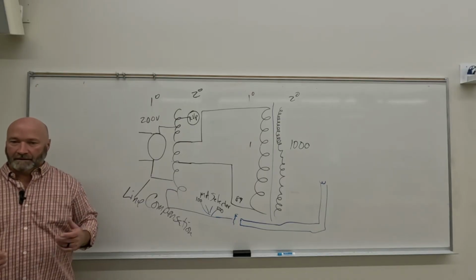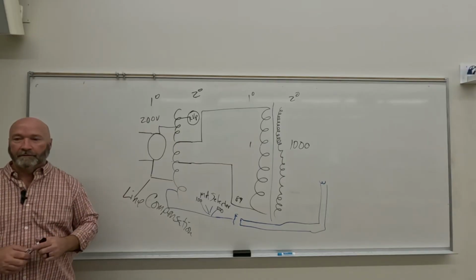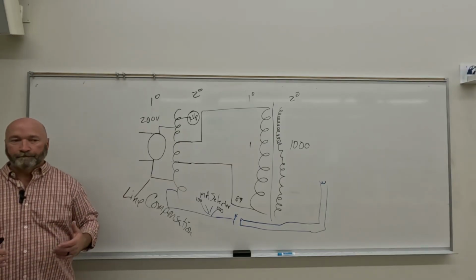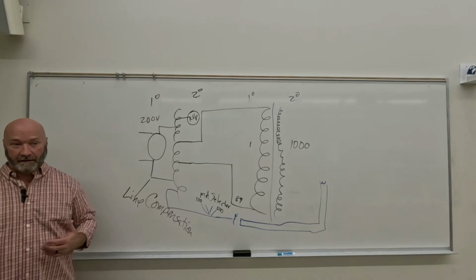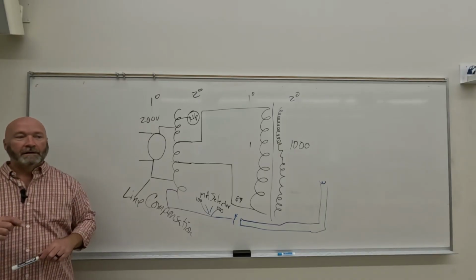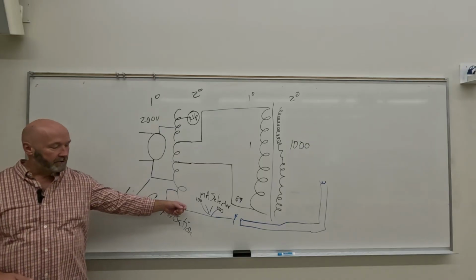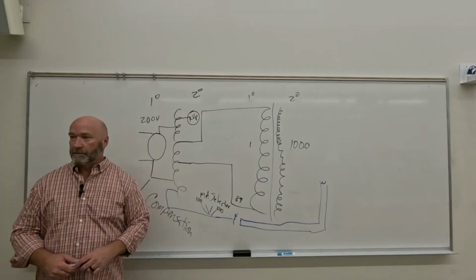They're moving. And what happens when things move while you're taking a picture of them? They get fuzzy, they get blurry, and if the vertebra remains still, you can actually see the vertebra better if the patient's moving. So is there a time to use low mA and long exposure time?